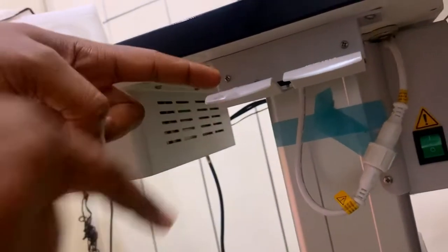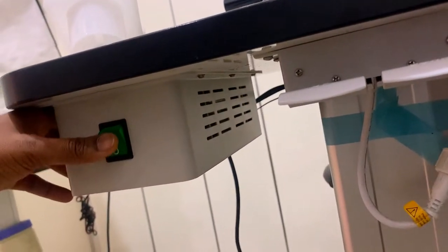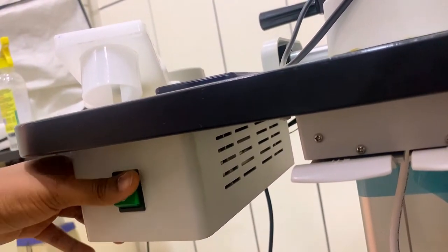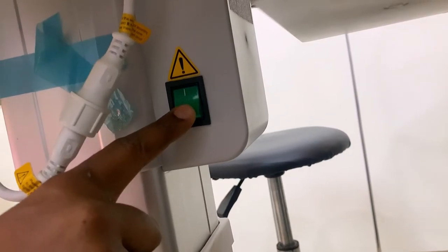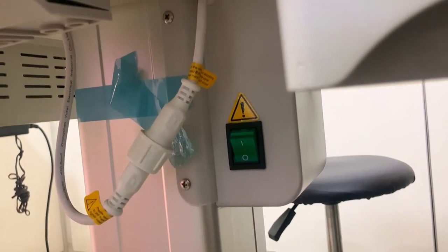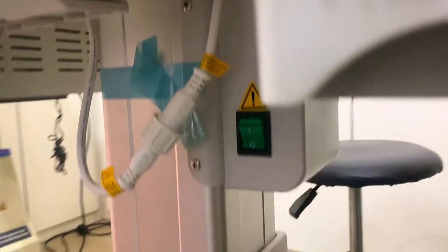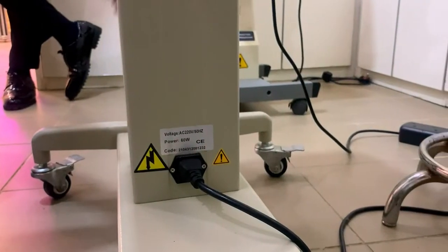After that, this is the table adjustment lock. You can see here it is written 'up' and 'down' — this is what helps you to raise or lower the table. Here is the switch for putting off and putting on the slit lamp biomicroscope. The table also has its own switch. Remember: this switch is for the slit lamp biomicroscope and this one is for the table. So even if the slit lamp switch is on, if the table switch is not on, you cannot operate the table adjustment lock. When it is on, it allows you to raise and lower the table. After the table switch, the next thing is the plug — this connects the table to the socket so that you can put on the switch.